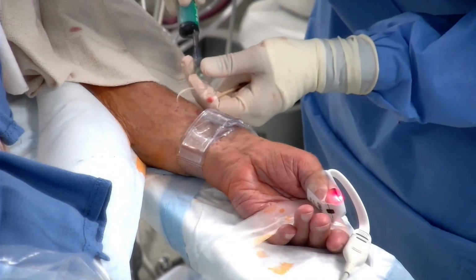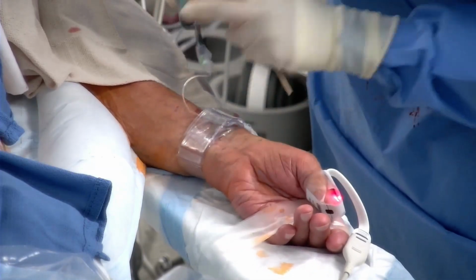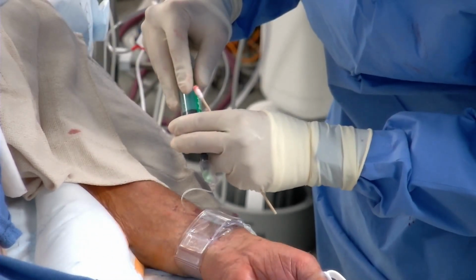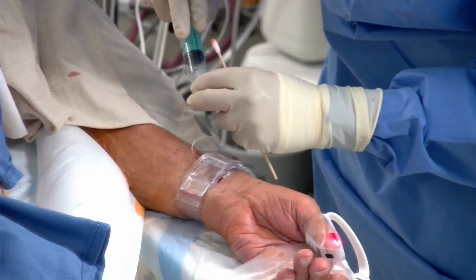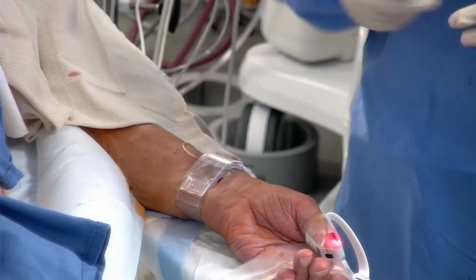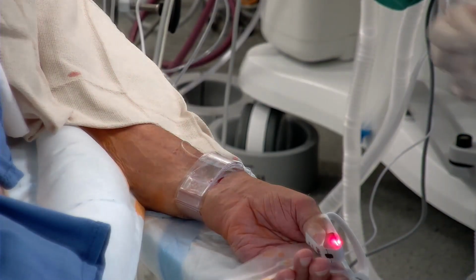So now what he's going to do is slowly let a little bit of air out until he sees blood coming out of the arteriotomy, and then he'll just put in 1 cc more. And we'll leave it up. I like that technique, because that's always kind of annoying. There's a little bit of blood there, and I don't know. So that little Q-tip. Yeah, so we got about 14 cc's of air in there.